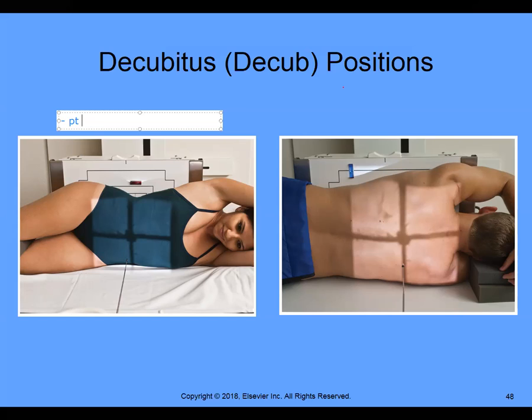So I'm going to put here, patient is lying down on a horizontal surface.